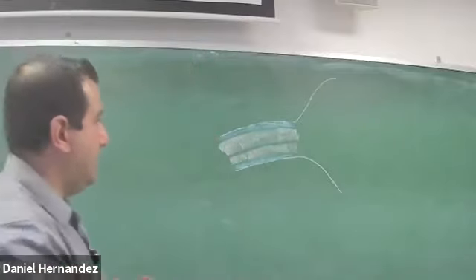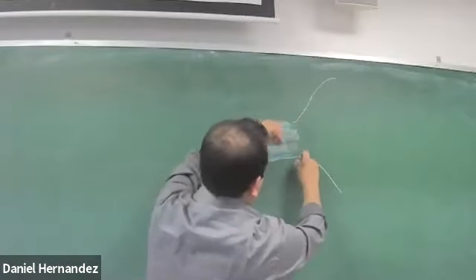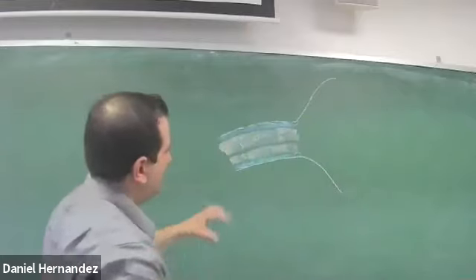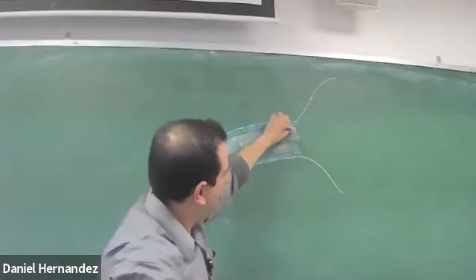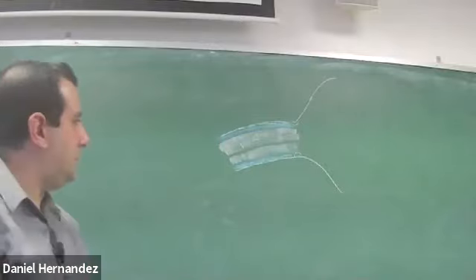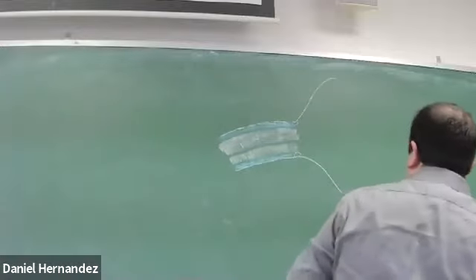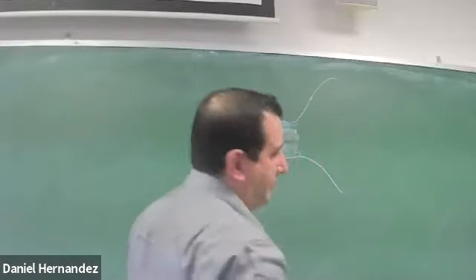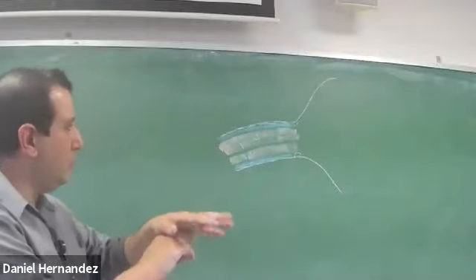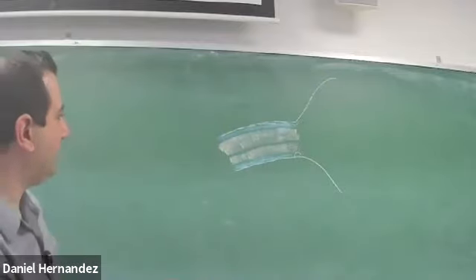stenosis. A normal pyloric muscle, you may not even necessarily appreciate. They're just going to be small little muscle on either side of your channel. So this will be closed and your little muscles will be right there. So in a normal study, there typically isn't much for you to measure. One of our pediatric radiologists said if it's a normal study, they don't even want measurements. Just get your clip showing a nice normal looking pyloric channel, opening, fluid going through.